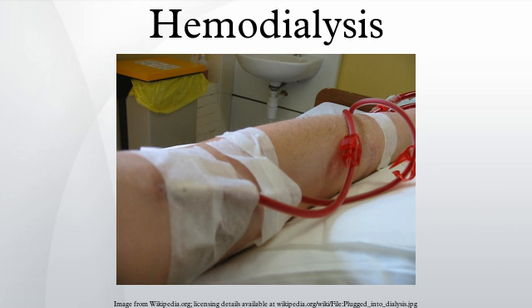AV graft. AV grafts are much like fistulas in most respects, except that an artificial vessel is used to join the artery and vein. The graft usually is made of a synthetic material, often PTFE, but sometimes chemically treated, sterilized veins from animals are used. Grafts are inserted when the patient's native vasculature does not permit a fistula. They mature faster than fistulas, and may be ready for use several weeks after formation.